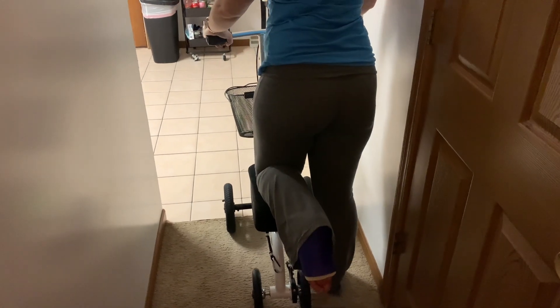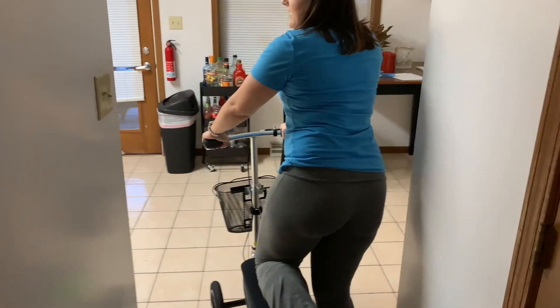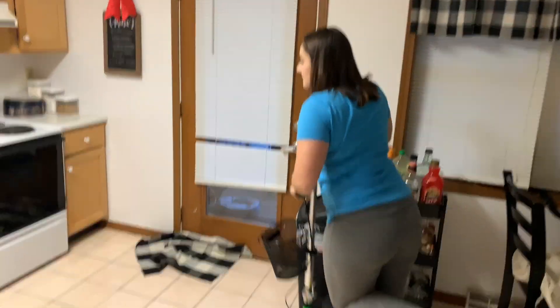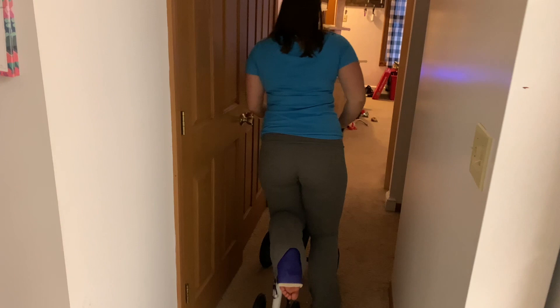At this bump I always try to lift my knee up a little bit because the bump does not feel good on my ankle, and then I just steer around after those.